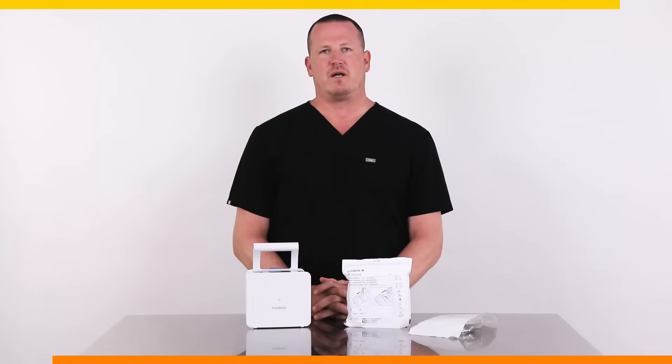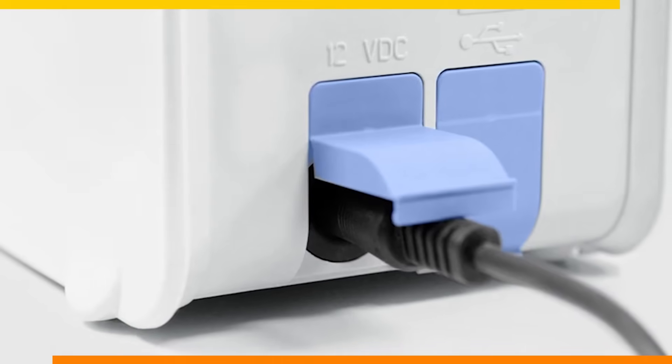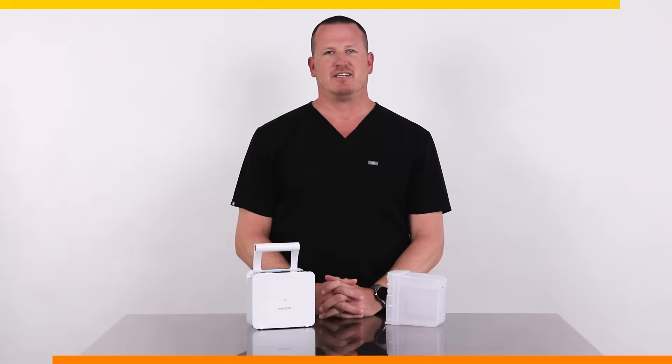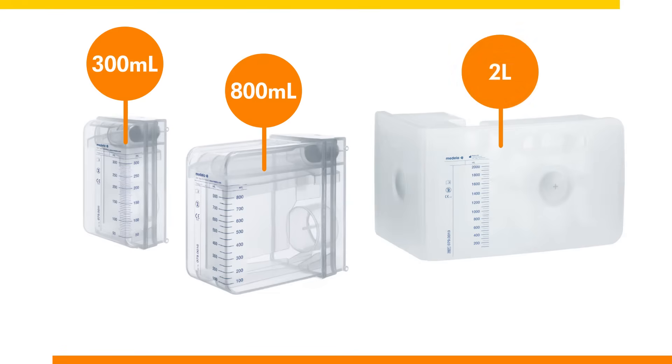The Topaz Plus can run while it's plugged in or on battery power. The average battery life is 10 hours. We recommend plugging in the Topaz Plus whenever the patient is at the bedside. There are three different sizes of canister available with or without a solidifier: 300 milliliter, 800 milliliter, and 2 liter.